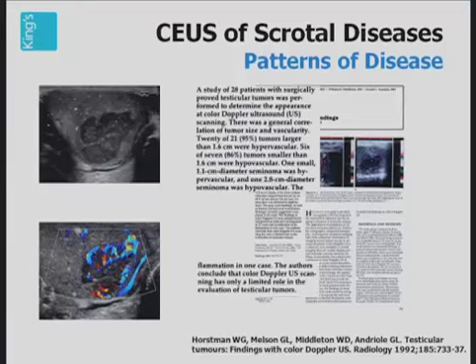The authors concluded that a color Doppler ultrasound was not useful for those tumors less than 1.6 centimeters, but now, with the advent of better technology, we know we can ascertain color Doppler flow in the very small lesions. An indication of malignancy is therefore the presence of hypervascularity. A benign lesion should demonstrate no increase in vascularity. This is the hallmark of investigation of the focal testicular lesion with an ultrasound examination.